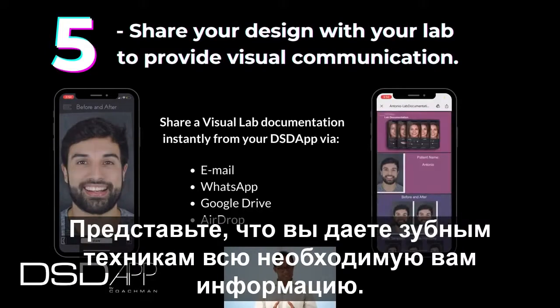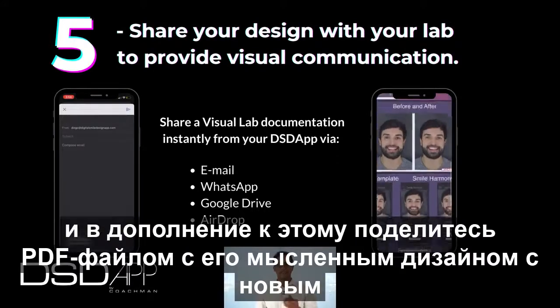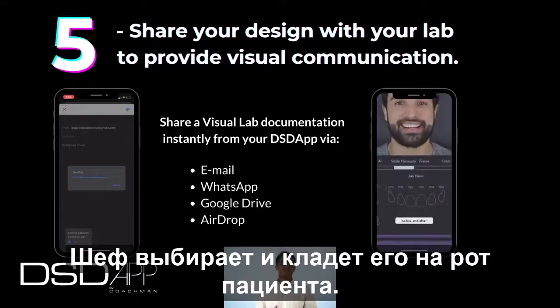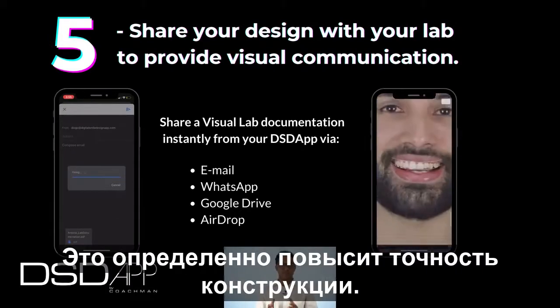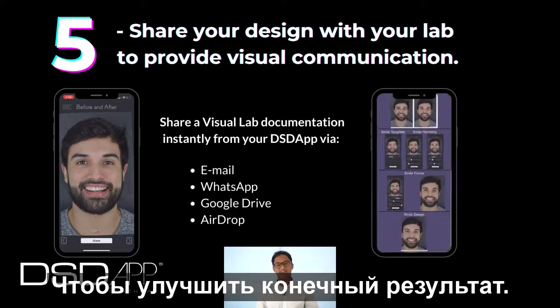Imagine giving your dental technicians all the information that you want, and in addition to it, sharing a PDF file of this design with the new teeth selected digitally and placed over the patient's mouth. It will definitely increase the accuracy of your structures so as to enhance the final outcome.